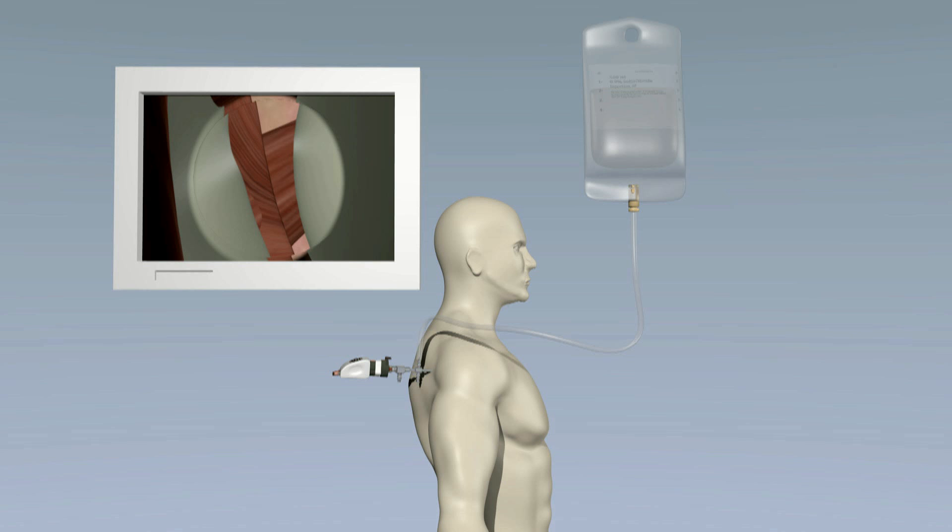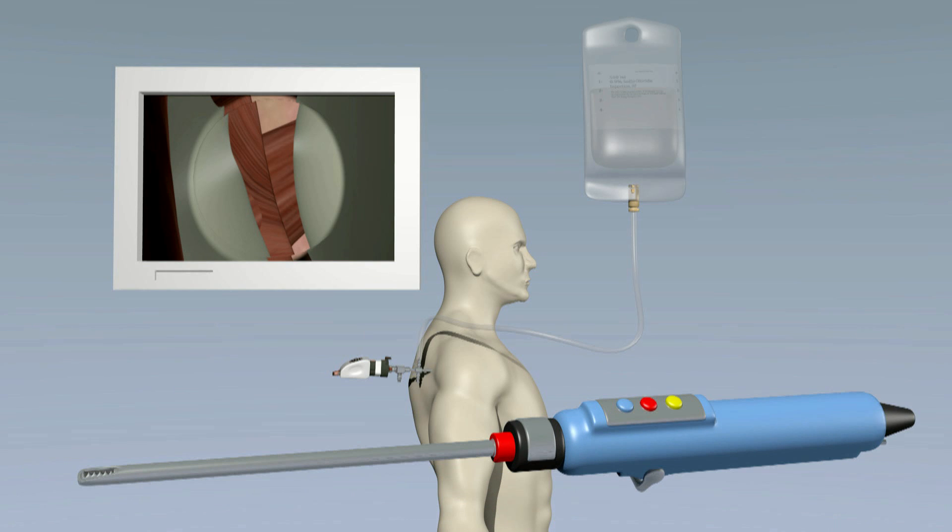One of the most commonly used instruments in shoulder arthroscopy is the electric shaver. A shaver has tiny rotating teeth that gently shave away unwanted cartilage and joint tissue.